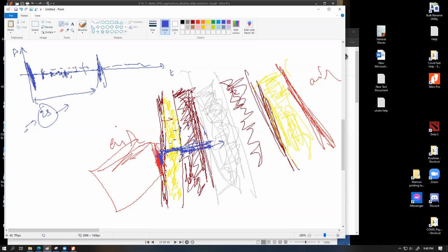In that process, it scans the whole thing, and the ultrasound probe basically can measure what intensity of sound wave it received. It does not sense any color. Later, the individual intensities of these sound waves are given different colors so that we have a contrasted picture which our eye is comfortable with.